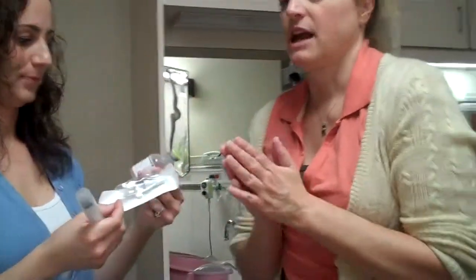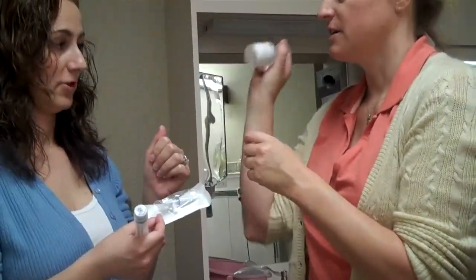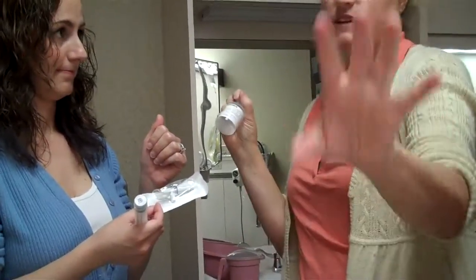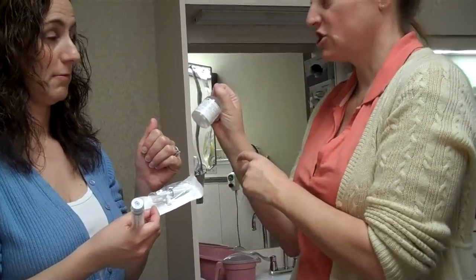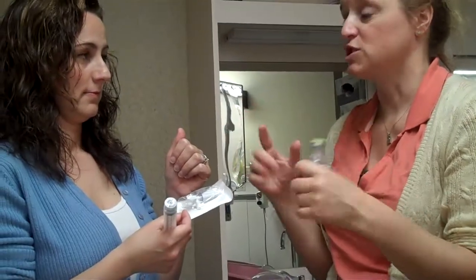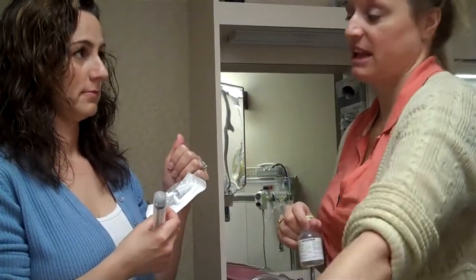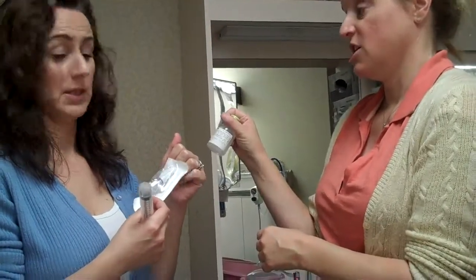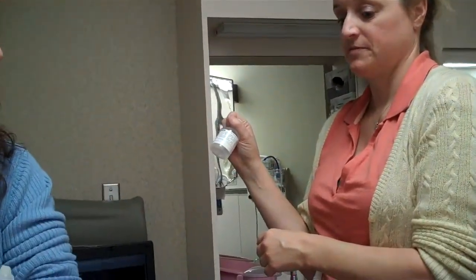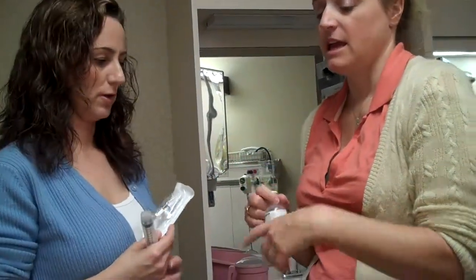The thing to keep in mind: anytime you go to give him medication, you flush with saline first, give the medication, flush between, and then you would be done. Since he's going to be giving 2 meds, you're going to flush, give a medication, flush, give the next medication, and then flush. But the 2 of these can go back to back without a flush because they're the same medication. So just in between the 2 different kinds.